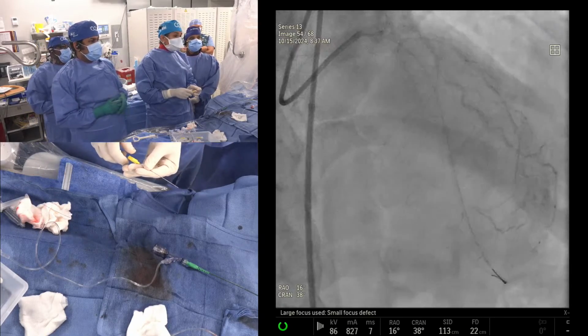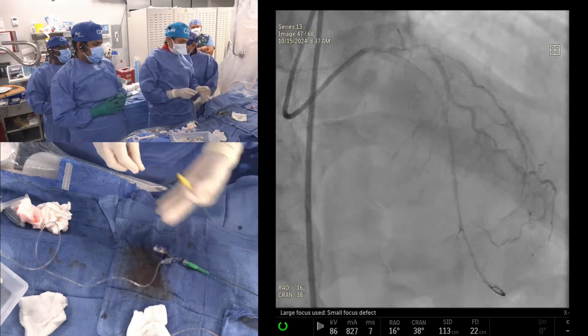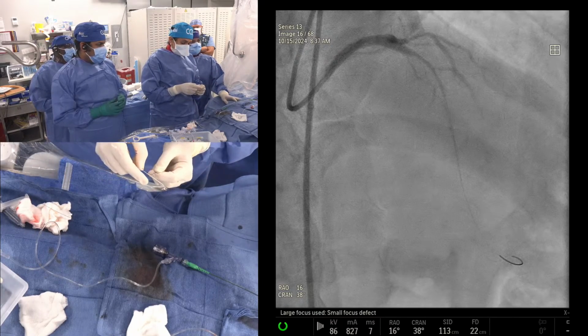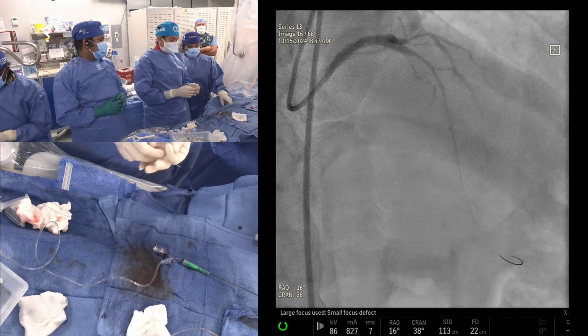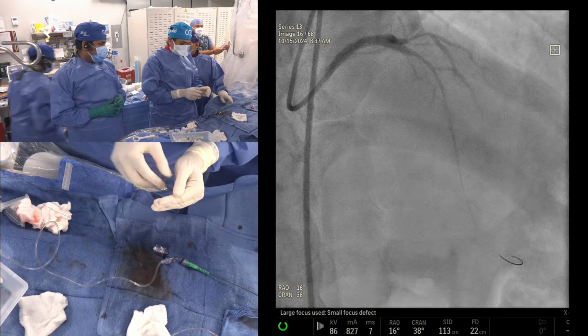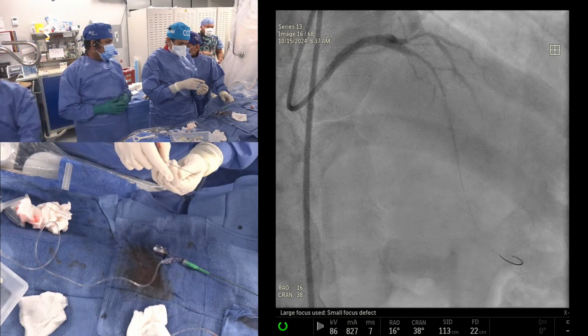No, we are talking LAD. I meant crush with the 6 French. Yes, exactly. 2.5, 2 stents will go, but a 2.75 will not. A 2.5, 12 non-compliant balloon, or give a 2.5 cutting balloon. Wolverine.